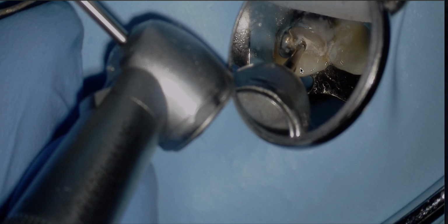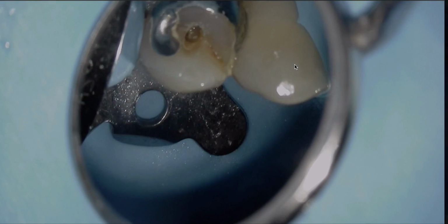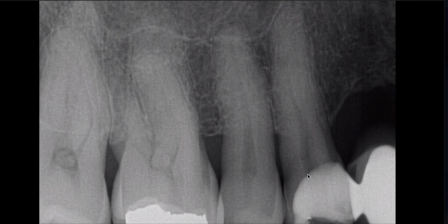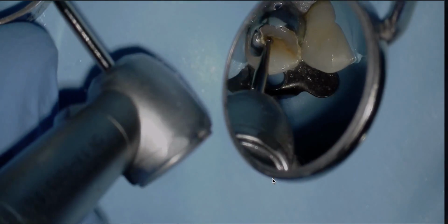There are 3 things going through my mind while I'm doing this. One is, don't go too far buccal-lingually. Two, make sure the angulation of this bur is correct along the long axis of the tooth. And three is just the depth. I use this little mark as the depth guide on my bur. I dropped in, because it is a fairly large pulp chamber, as you can see here, so I'm not too concerned about missing it, but I have done that before.